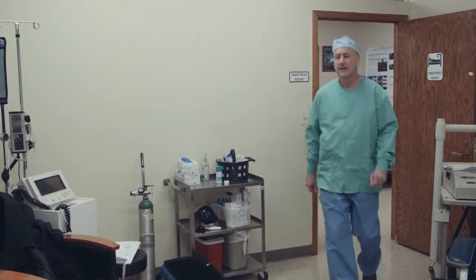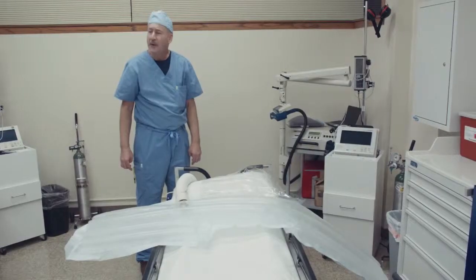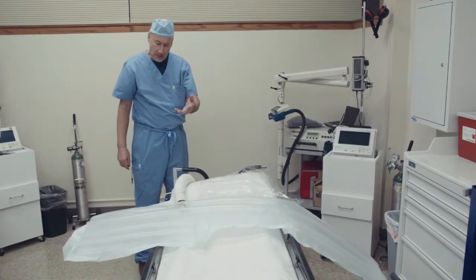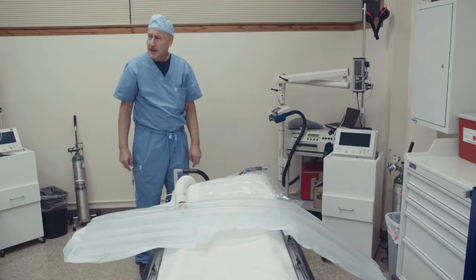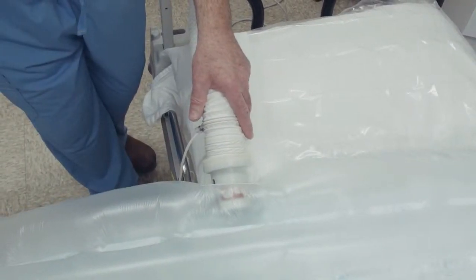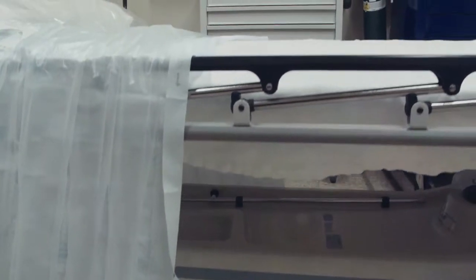Dr. Mark Silverberg has been a practicing anesthesiologist for 30 years. The coldness is a real health hazard, so there are companies that developed ways to keep patients warm when they're undergoing surgery. Lawsuits allege these devices actually cause infections. How? Their forced air comes out of these holes. Lawyers say that swirls up contaminated floor dust right onto the surgical wound.